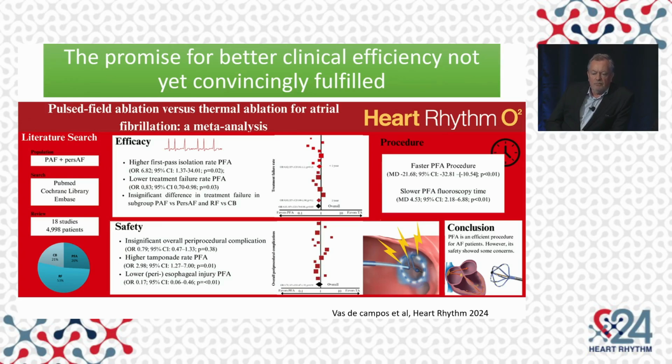For the sake of time, I'll limit myself to this recent meta-analysis of 18 studies comparing PFA to RFA, comprising 5,000 patients, and they found a very small signal towards a lower treatment failure with PFA. PFA procedures were faster in exchange with these largely single-shot procedures. There was a higher tamponade rate and longer fluoroscopy exposures.